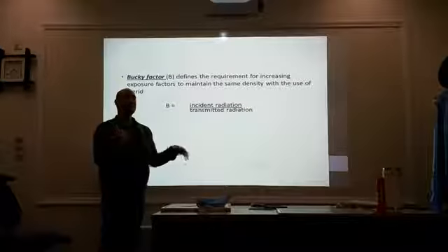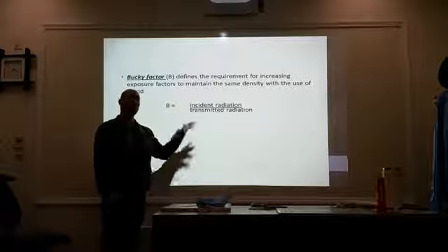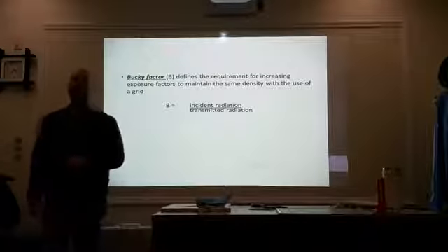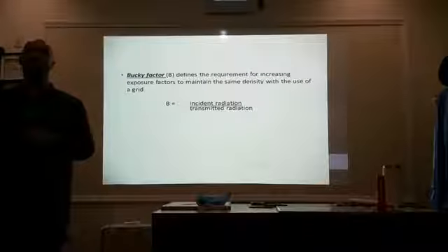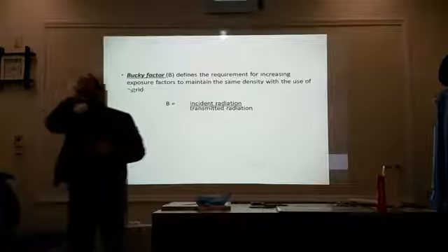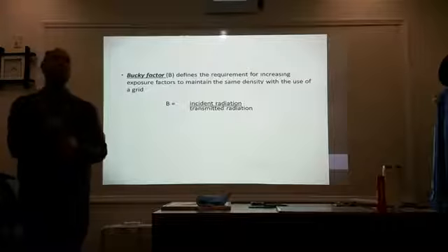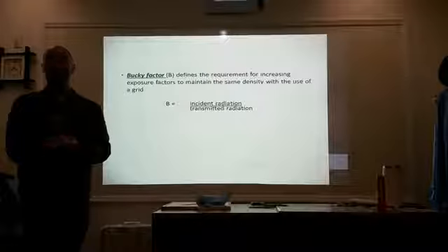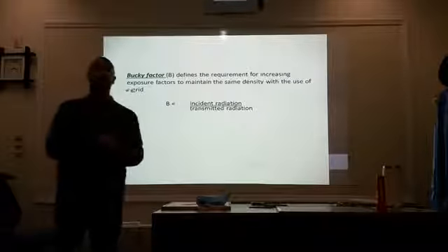So between an 8:1 and a 16:1 grid ratio, which of the two are we going to employ higher technical factors with? A lower grid ratio or a higher grid ratio? Lower? Higher, yeah, well, it was 50-50, right? So it's going to be the higher grid ratio because it has a better efficiency of getting rid of scatter. It's also removing a lot of that density. So we've got to use higher technical factors than you would with a lower grid ratio.